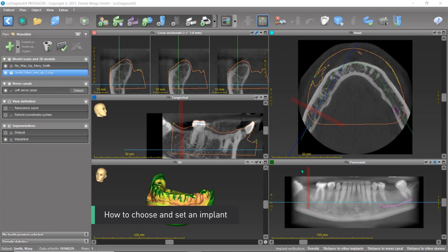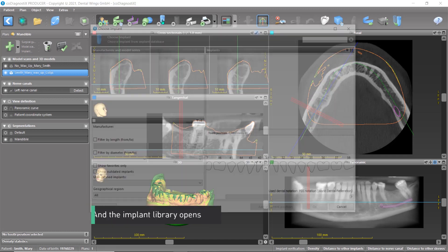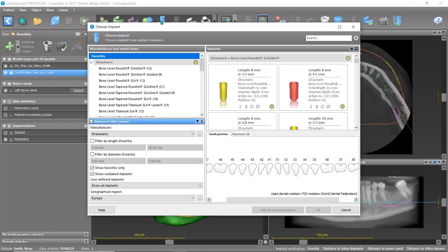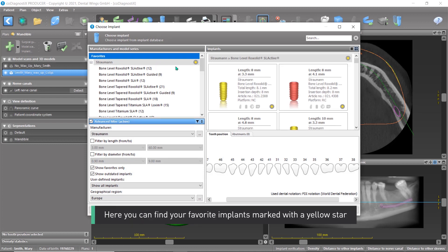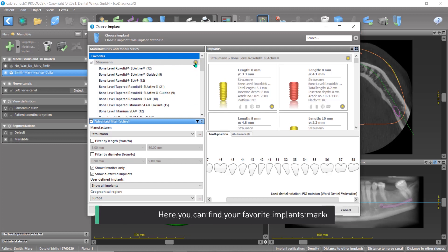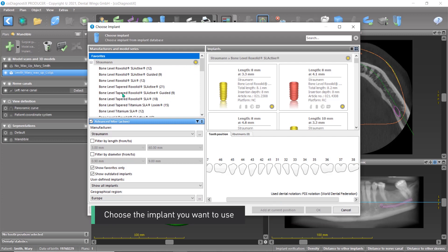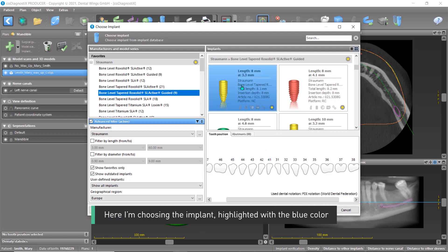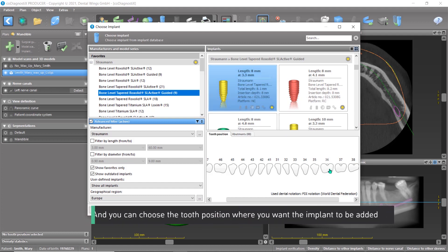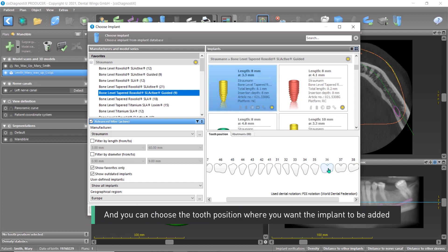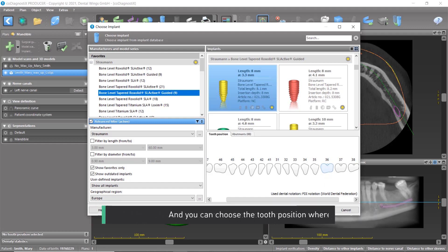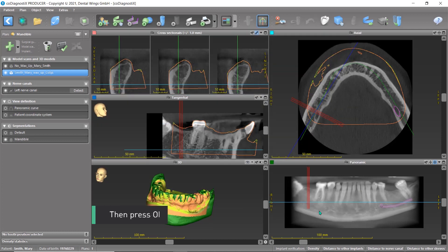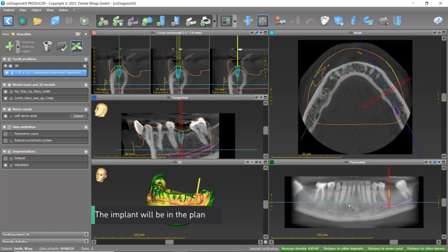To choose and set an implant, click on the implant icon and the implant library opens. Here you can find your favorite implants marked with a yellow star. Choose the implant you want to use — here I'm choosing the implant highlighted in blue. Select the tooth position where you want the implant to be added, then press OK. The implant will now be in the plan.